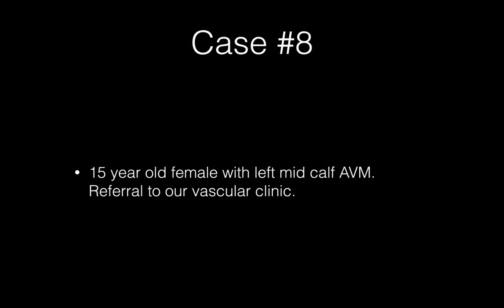Hey, Shreyas, I have a question about T2 shuffling in clinical settings. So it has a lot of different contrasts. So how do you leverage different contrasts to make diagnosis? Yeah, so I usually look at the way that it's set up. It reconstructs at 3 different effective echo times. I usually just look at the middle one, and then if I want to see some subtle edema, I'll look at the long echo time image.